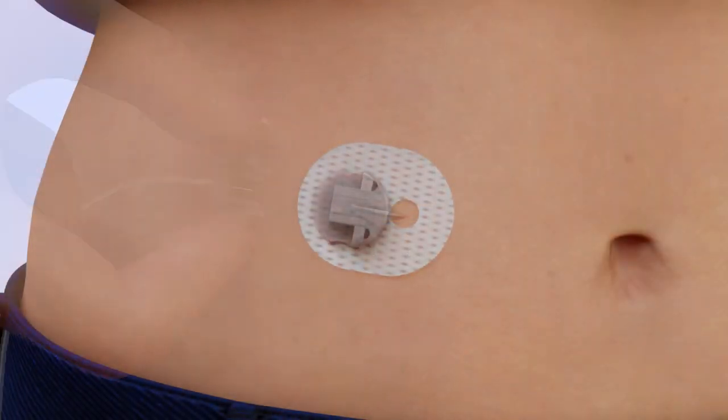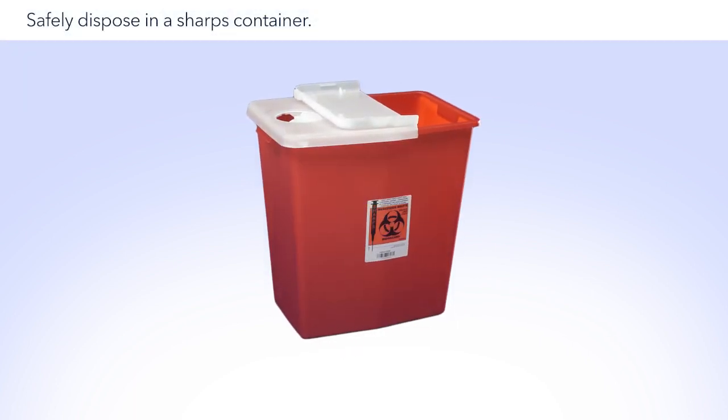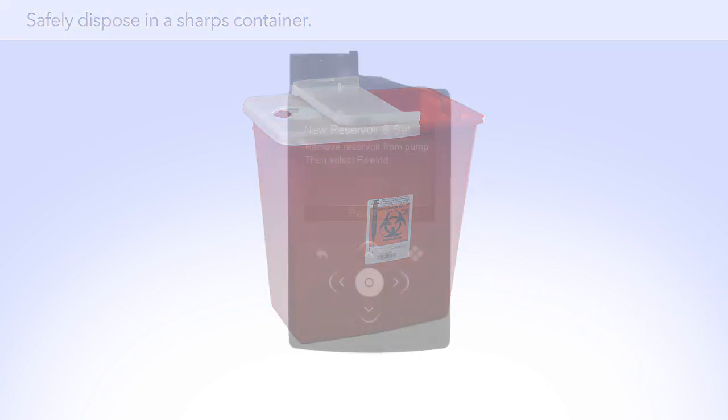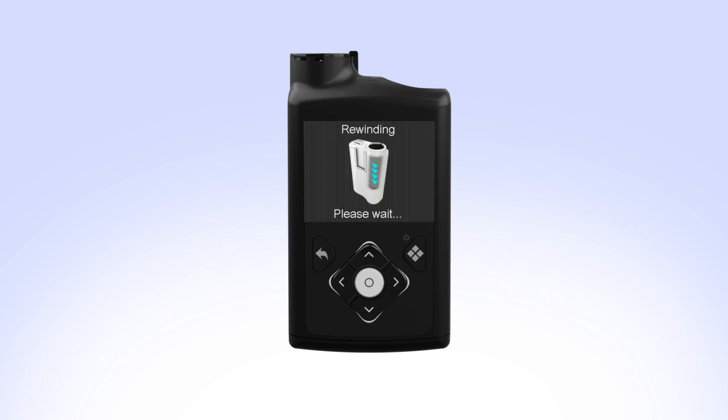Remove the infusion set you are currently wearing from your body. Pick up your pump and select Next. Then remove the reservoir from your pump by turning the tubing connector counterclockwise. Safely dispose of the used infusion set and reservoir. On your pump, select Rewind. The Rewinding screen will appear while the piston rewinds.